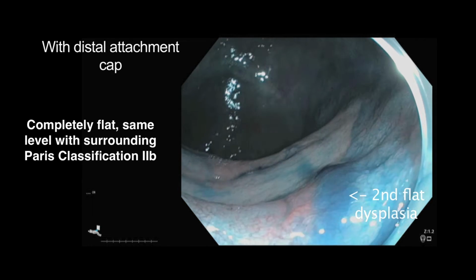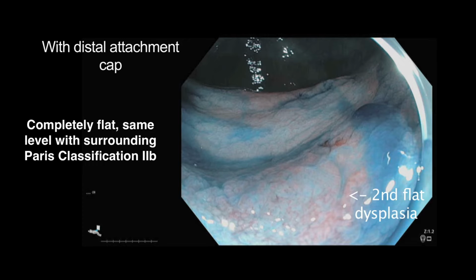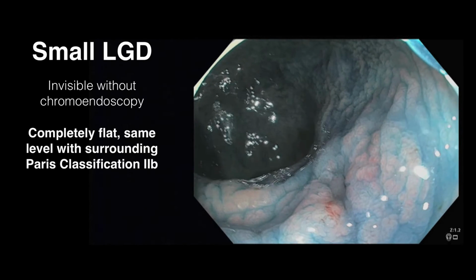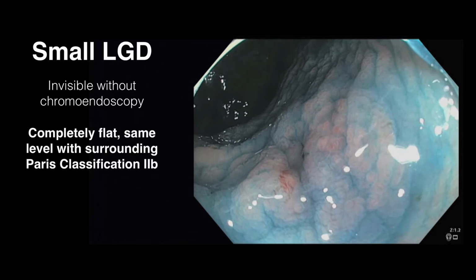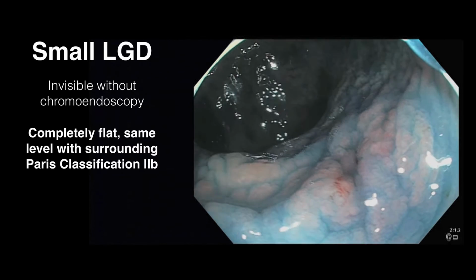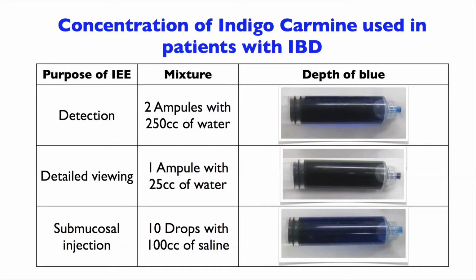Indeed, upon further inspection of the neighboring mucosa, a synchronous flat dysplastic lesion is seen. A small, completely flat Paris 2B dysplastic lesion, as shown in this case, would be quite a challenge to recognize without chromoendoscopy. Using high-definition instruments, we perform image-enhanced endoscopy with indigo carmine using 3 different concentrations.